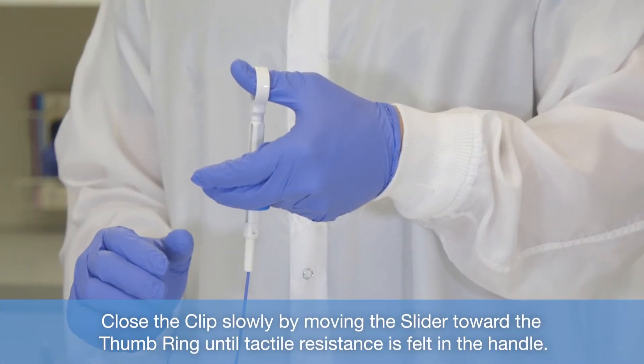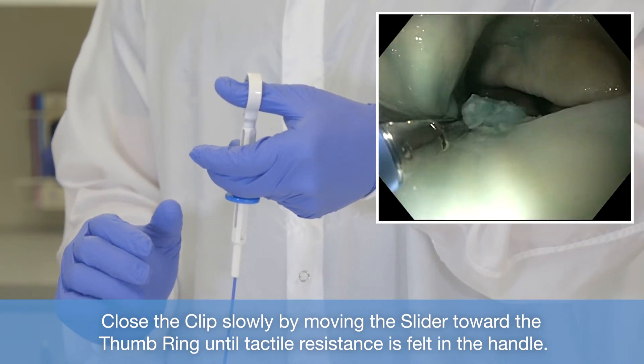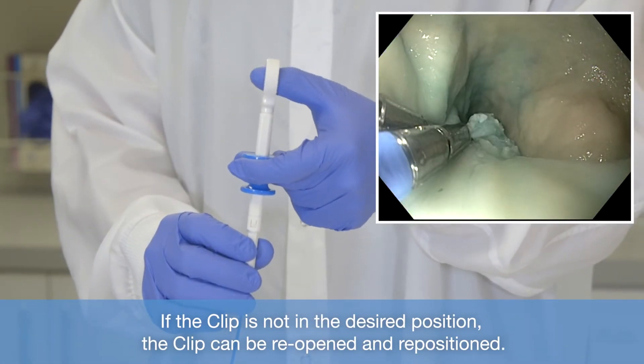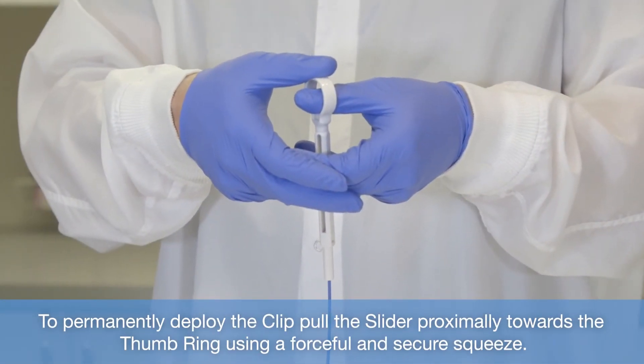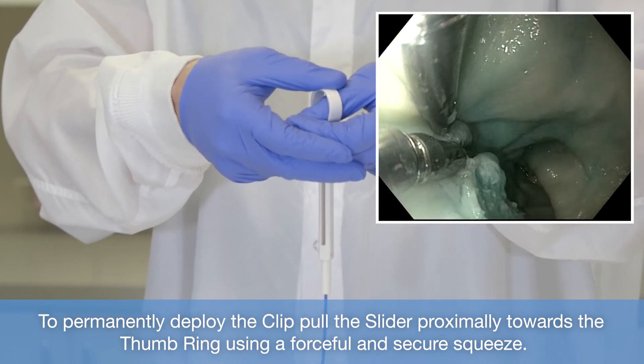Close the clip slowly by moving the slider toward the thumb ring until tactile resistance is felt in the handle. If the clip is not in the desired position, the clip can be reopened and repositioned. To permanently deploy the clip, pull the slider proximally towards the thumb ring using a forceful and secure squeeze.